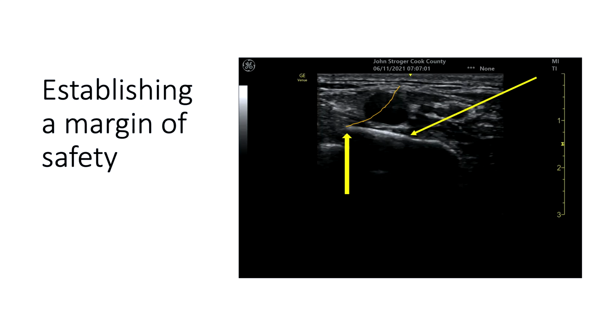Because they say, what else do you want? There is the needle. And indeed it is the needle. But now the needle is not in this image. And notice that this image is a flat image, as much as the pages of a book are flat images and parallel to each other. So when you were reading an old-fashioned book with a bookmarker, and you dropped the book and the marker went away, and the Good Samaritan came and put the marker back, although the position of the marker is parallel to where you were, it is not in the right page, most likely.